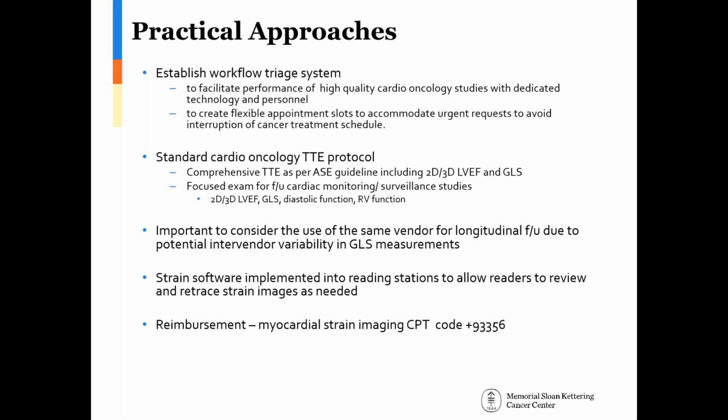Some labs will designate the same system so that you don't have that multi-vendor variation, and also have the techs that are familiar with the protocol so that you can get high quality 2D images and end up with good quality, reliable strain results. Obviously, in order to set up a successful cardio-oncology echo lab, you really have to have flexible appointment slots to accommodate urgent requests, because cancer treatment schedules often are not flexible and cannot be delayed.